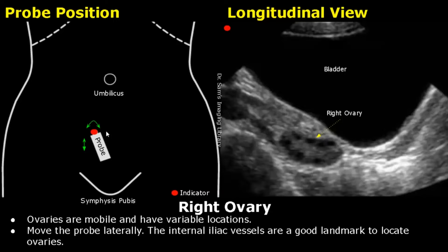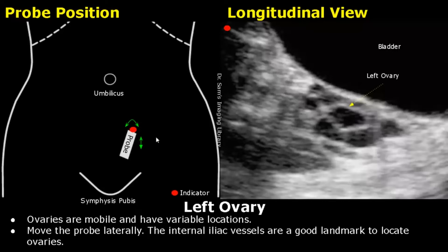First, we will see the right ovary. Move the probe laterally and slightly oblique to locate the right ovary. We will get this image showing the ovary in longitudinal view. In a similar way, move towards the left side to scan the left ovary in the longitudinal plane. This is the left ovary.